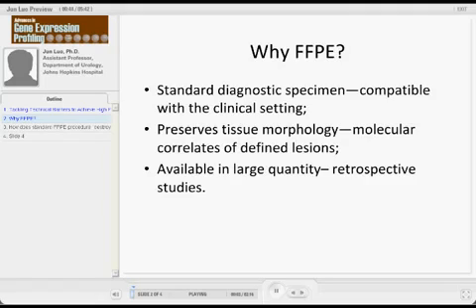One thing with my affiliation with Hopkins is we have a long history of frozen tissue collection. We have in the tissue bank about 2,000 frozen tumor samples, and I actually took advantage of those. In the past 10 years, I have been using frozen samples. So why would I get into this trouble with FFPE, paraffin blocks? For three specific reasons that have something to do with my research interest overall.